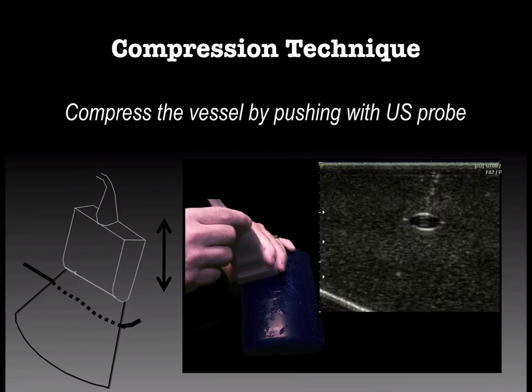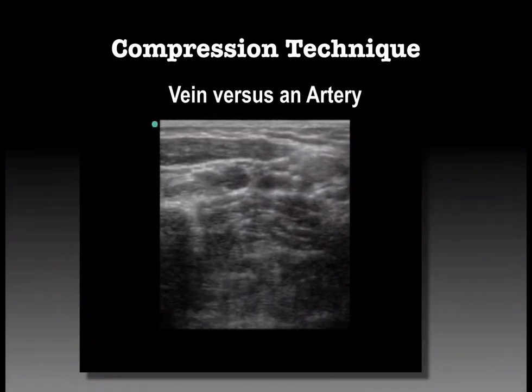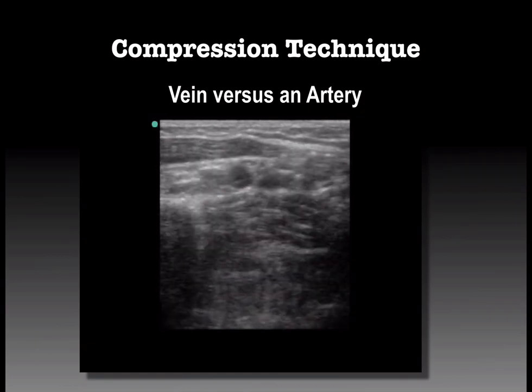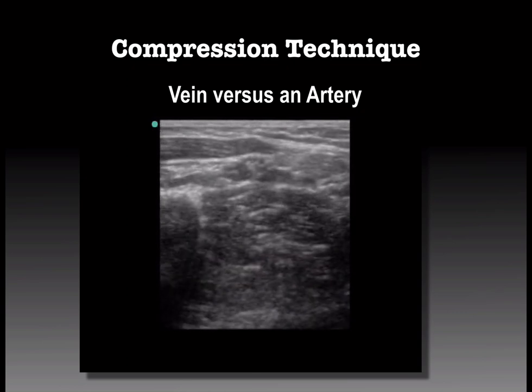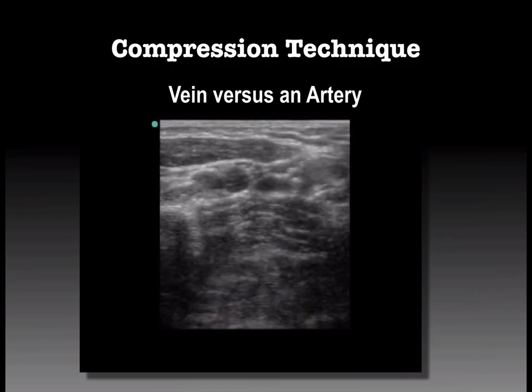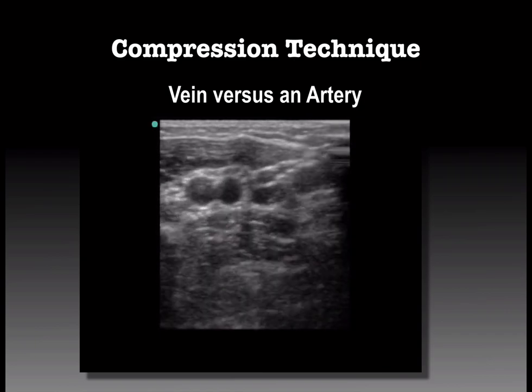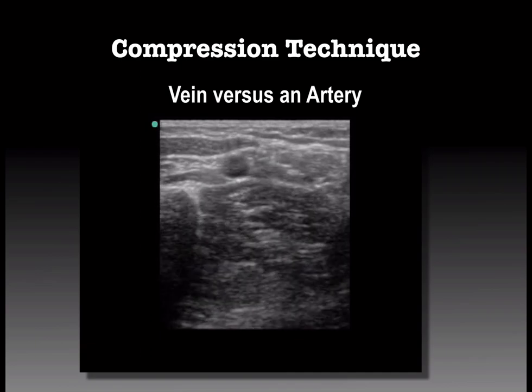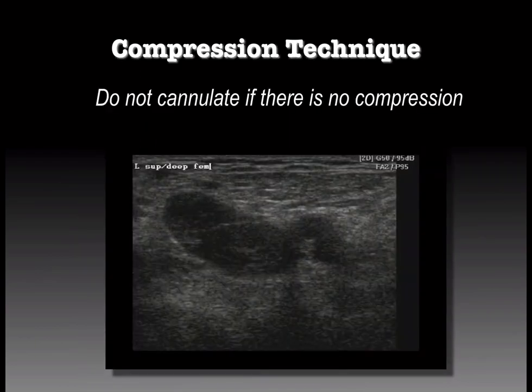Veins are low pressure, so they wink at you very easily with transducer pressure, whereas arteries have higher pressure and will pulsate open with systole. Nerves and clotted vessels will not compress generally, no matter how hard you push. So here's a picture of an arm. We have several pipes running up and down the arm. We can see in cross-section that the vein is winking at us with a little transducer pressure, whereas the artery is just indenting, and the nerves above it are staying the same. So now we can identify the artery, the nerve, and the vein, and we can pick our appropriate target.